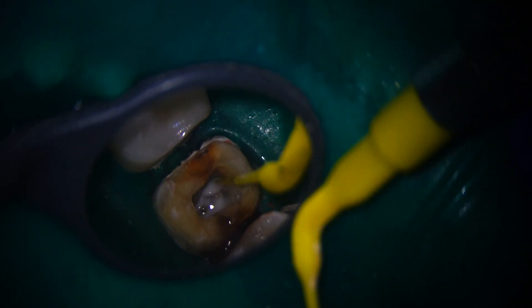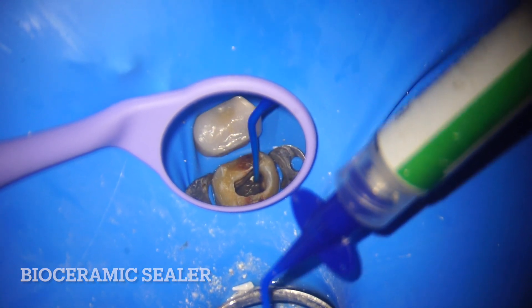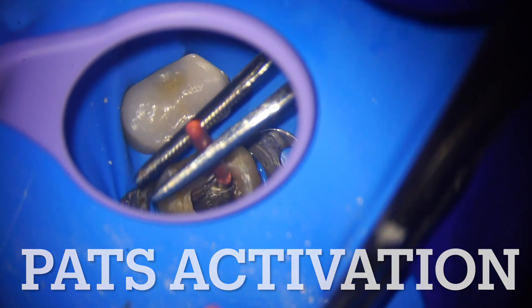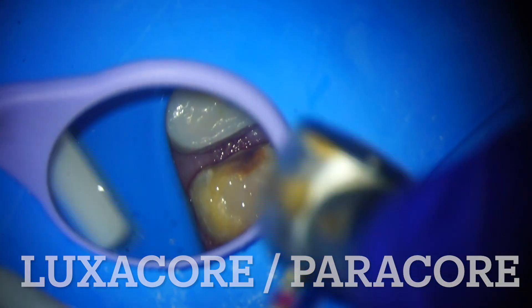This is calcium hydroxide placement in the first visit. Activating by PATS, then followed by obturation, then a core buildup using LuxaCore. In this case we generally use LuxaCore or ParaCore.